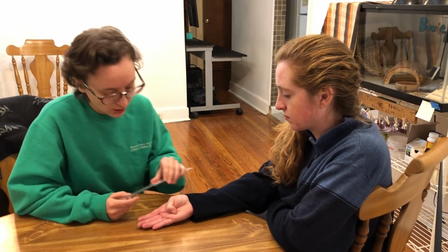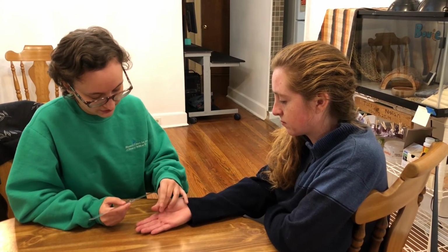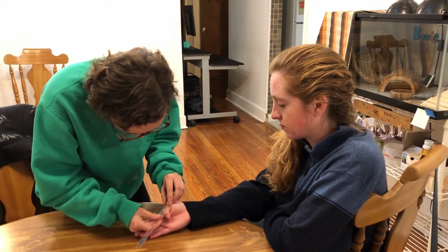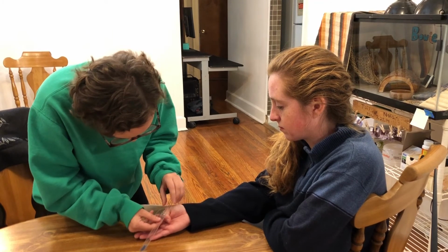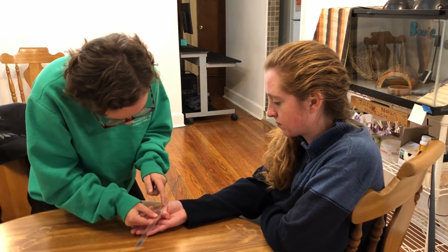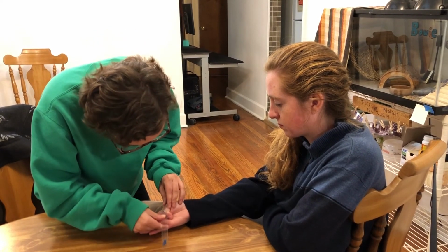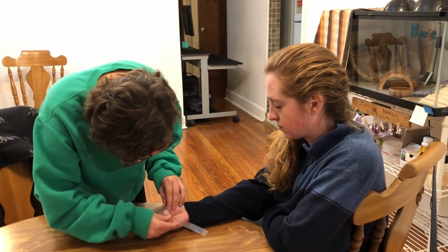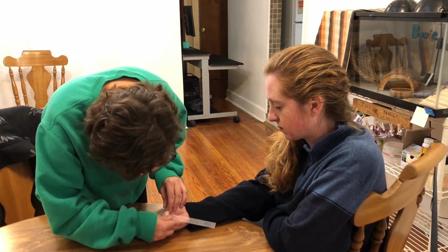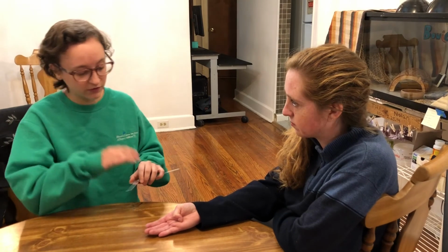Okay, now I'm going to measure IP flexion, so you can go ahead and relax for a second there. Okay, now go ahead and give me that movement back. I'm gonna place my fulcrum on the IP joint, my stationary arm in line with the first or the proximal phalange of the thumb. And now I'm gonna line up my movement arm with the distal phalange of the thumb. And we're getting 90 degrees, which is normal for IP flexion of the thumb.